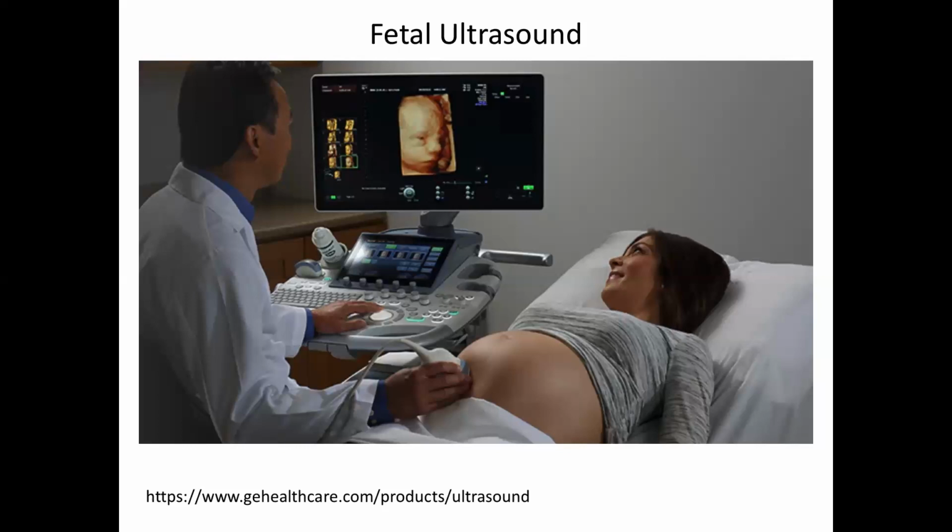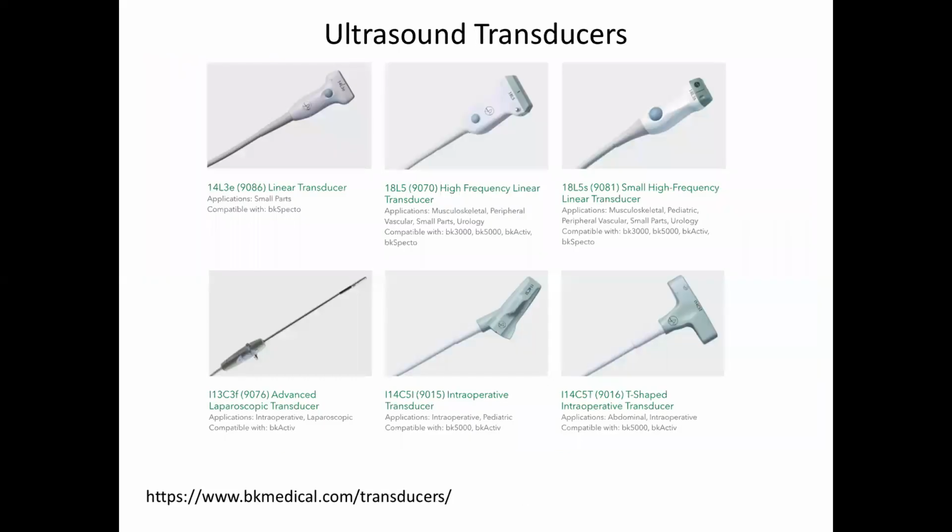And valuable information about development, etc. We looked at this in the introduction. Again, this is all review. As we'll see, in the construction of these transducers, there's a line of crystals that vibrate at very high frequency along the transducer, and you can create them with different geometries.